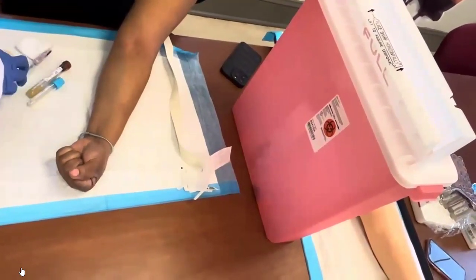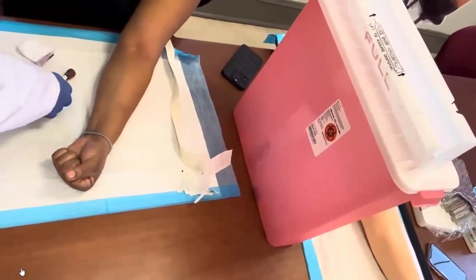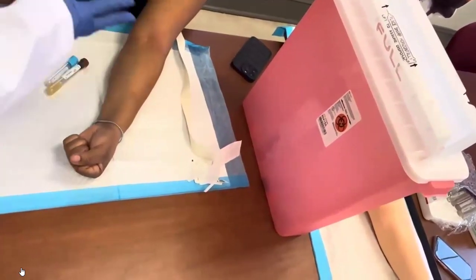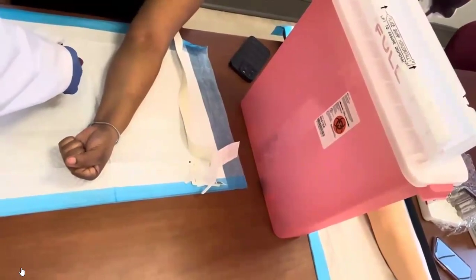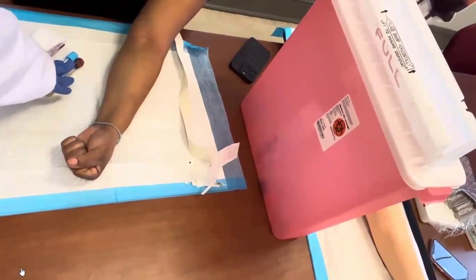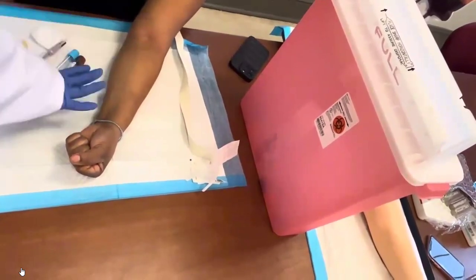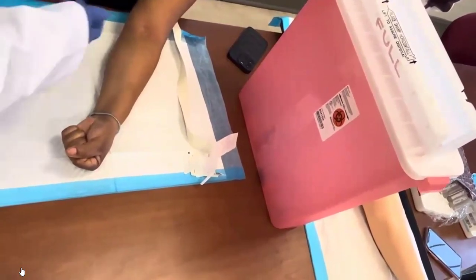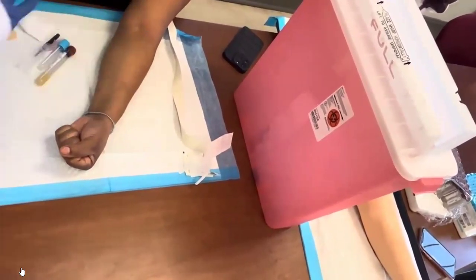Also, another thing too, I usually sit my tubes in the order of draw, in the order that I'm going to pick them up, right? So if you know the order of draw, you know that this light blue is going to go first. Now, I'm just going to draw the light blue, but I just wanted to put 2 tubes right here to show an example. If you're doing multiple tubes, just go ahead and sit them in the order you're going to draw them. That way, it's easier to just pick them up and keep going, okay?